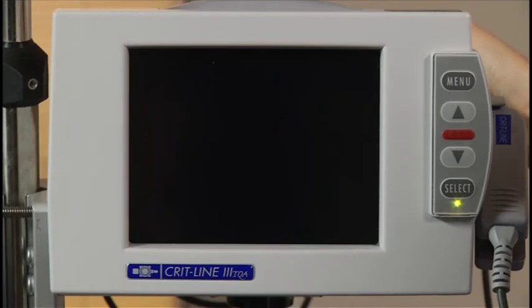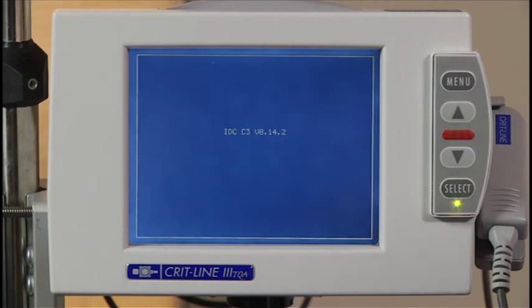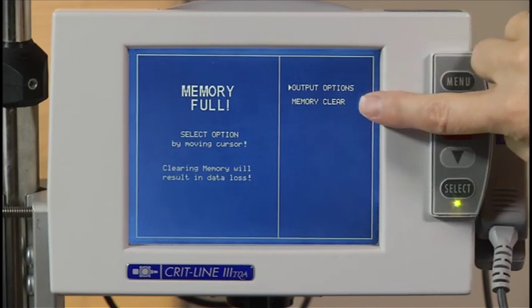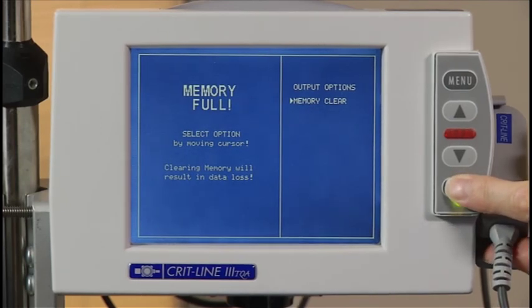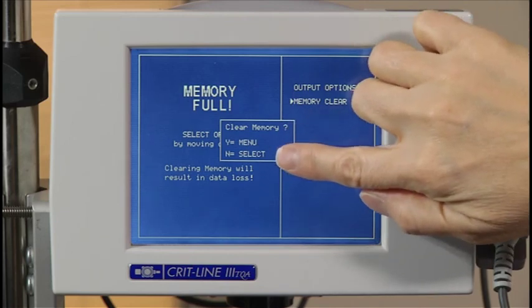If you turn the CRITLINE monitor on and there is still data in the memory, you will see the memory full screen where you will be prompted to either clear the memory or select output options. Once you choose memory clear, you will be asked to press the select button to confirm that you want to clear the memory. The memory should be cleared before starting a treatment.